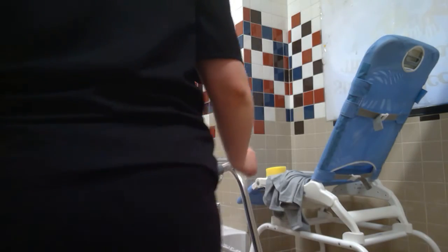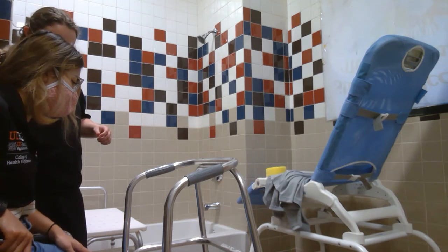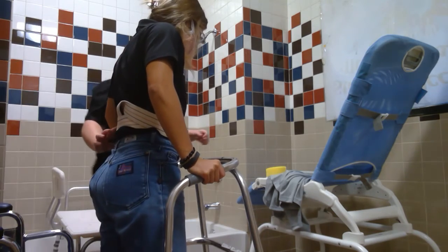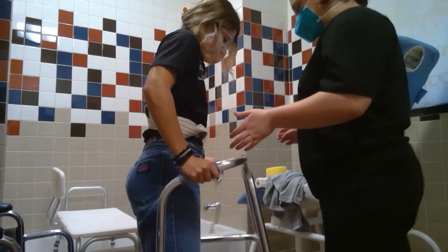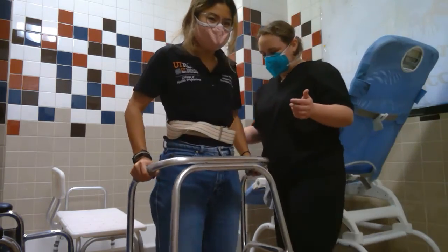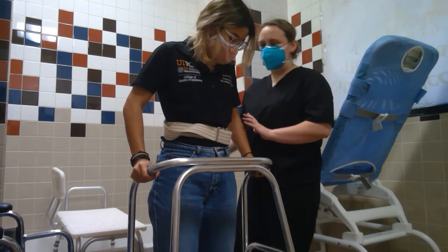All right. So whenever you're ready, remember how to, I'm going to knock off the camera. Push off with my arms and then push off with my strong leg. Okay. Get up and then grab the walker. And then do you remember how to turn? Turning using my strong leg. Yes. Great job. And then now we're going to carefully back up, all right? And then kind of like with the wheelchair, when your legs hit this bench, let me know. We'll sit you down, all right?